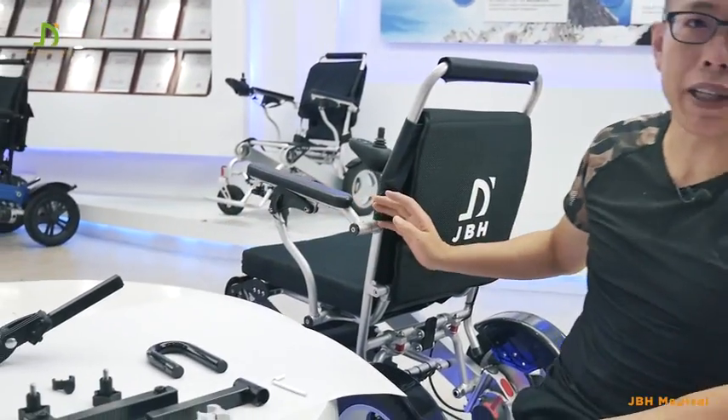My name is Kevin from JVH Medical. Today I'm going to show you how to fit the neck rest onto our DO9 wheelchair.